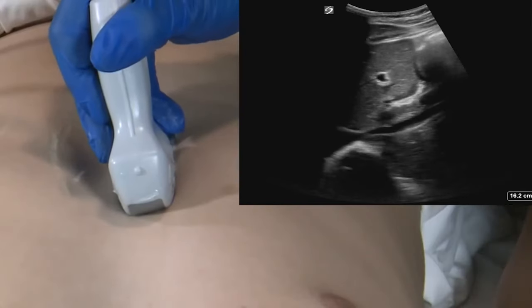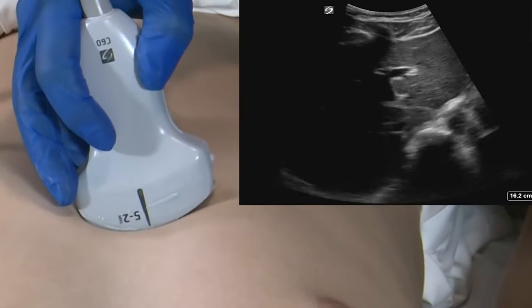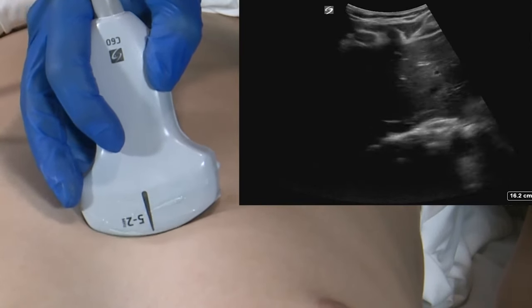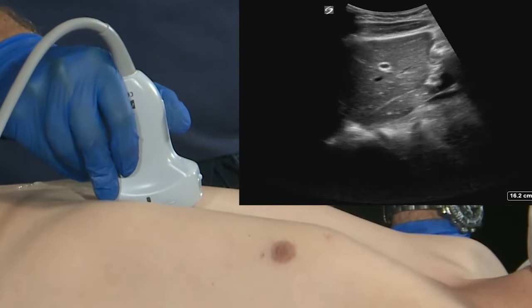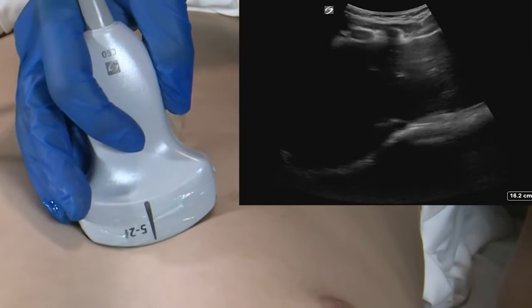However, if we rotate the transducer towards the patient's right, we are in the short axis or a transverse orientation of the body. These two orientations generally describe our probe placement: a sagittal orientation or a transverse orientation.